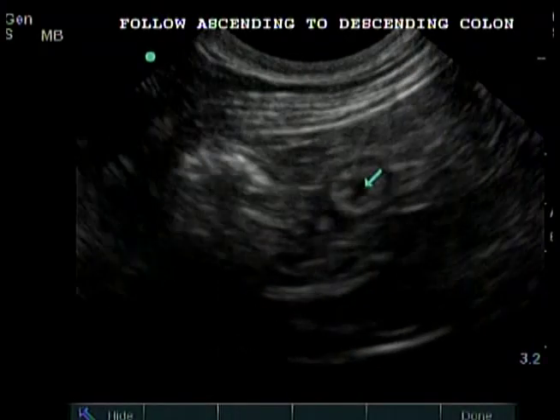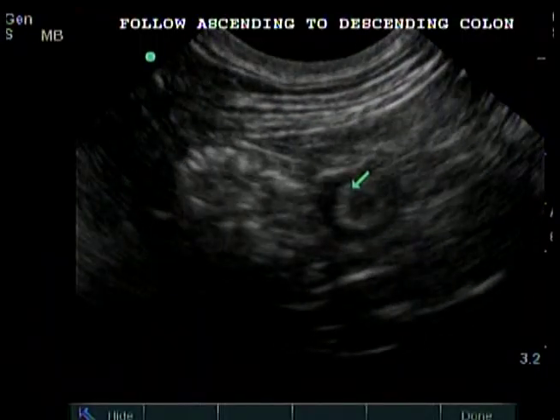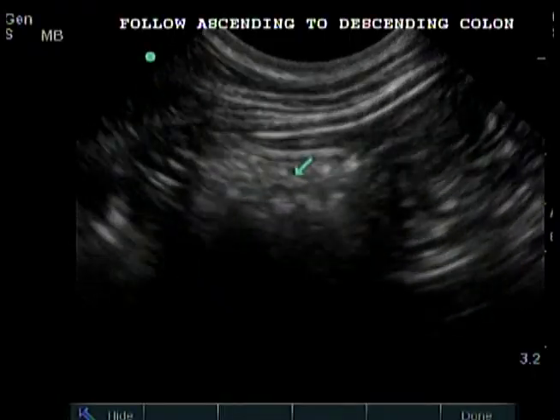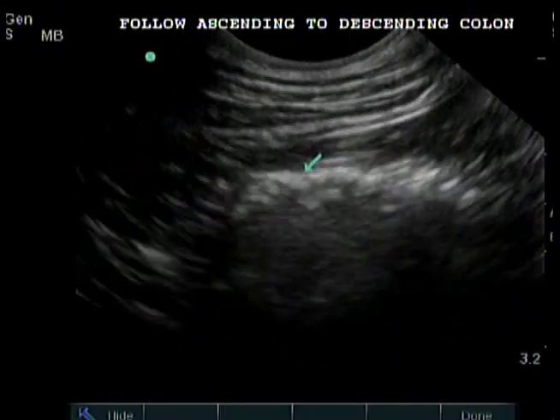This video shows the same process as seen in a cat. The presence of the ileum helps to identify the starting point. The transducer is in a transverse position and will slide cranially. The colon is seen in a short axis view. The right kidney will be seen as the transducer is advanced cranially. The short axis ascending colon will become a long axis transverse colon.